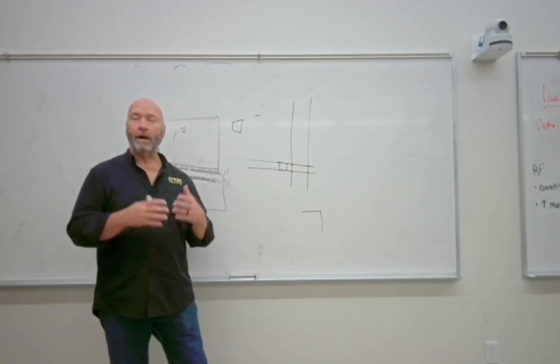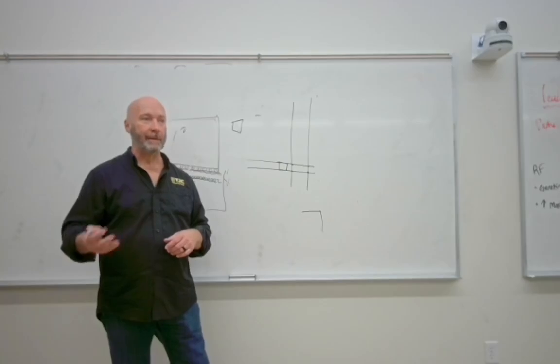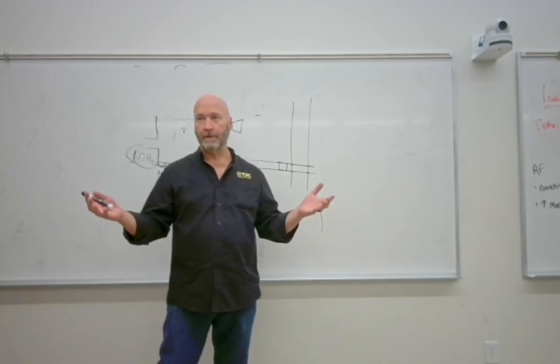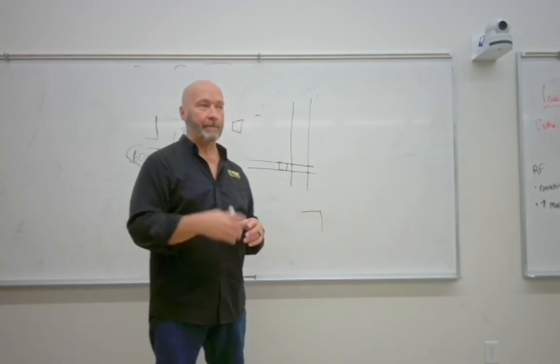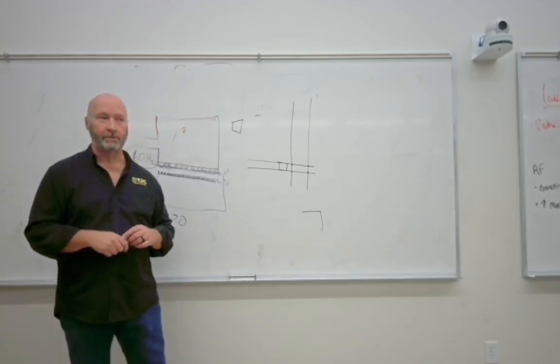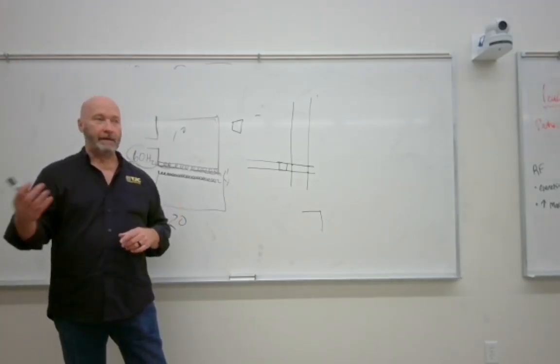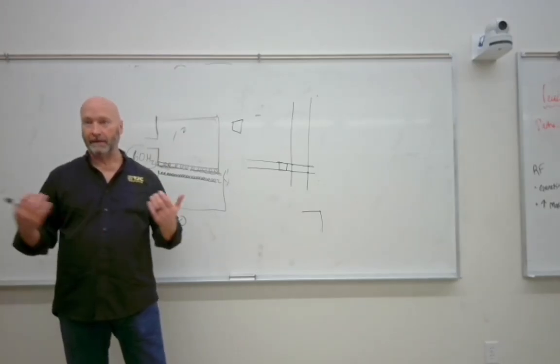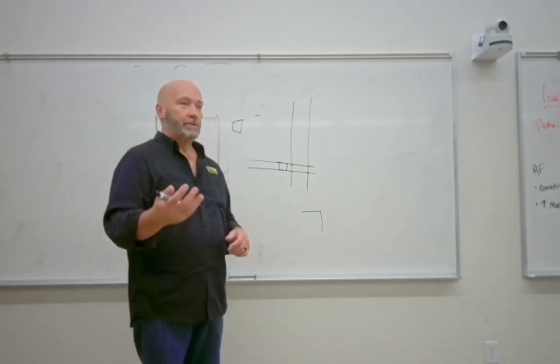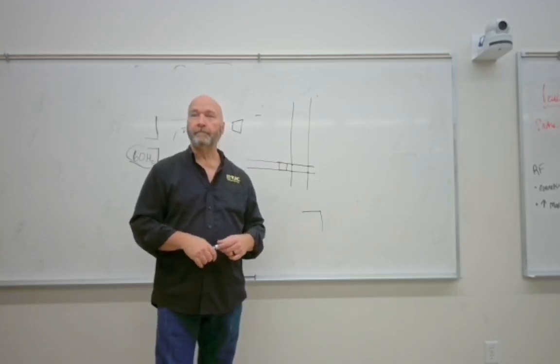Diagnostic systems have a wider range. Like Bushong says, the minimum energy on some, and he has to include a wide range because all manufacturers are not going to be the same, but minimum kVp 25. I think I've only ever worked on a few machines that you could get down to 25 kVp, because there's no reason to create an X-ray beam in a diagnostic room with 25 kVp ever, right? So most of the machines that you're going to use are probably going to be minimum kVp of 40.